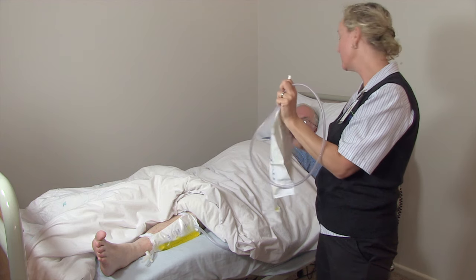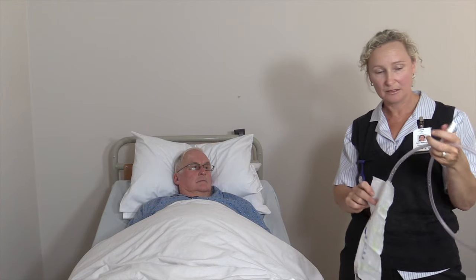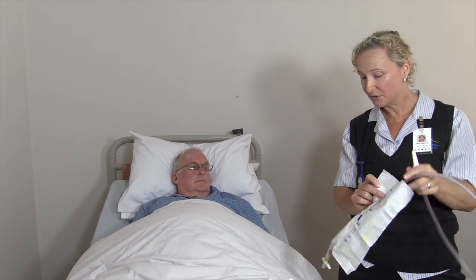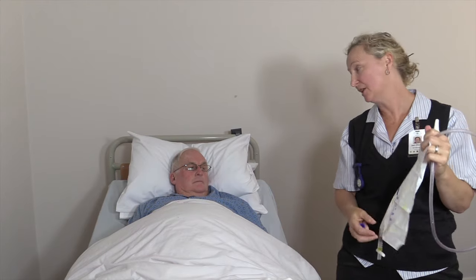In the morning, as these bags can be used for up to a week, you need to give the bag a rinse out. Just use some tap water, run it through, open it up and let it flush and then drain.